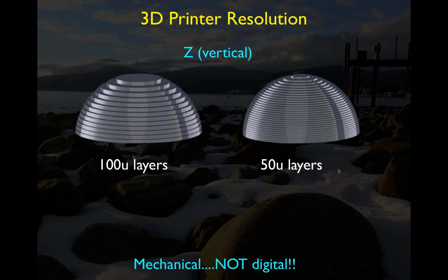And some of the printers, the transport for moving that build plate is not as accurate, and you don't get as consistent layers as sometimes you would hope for. That's a good question to ask about the accuracy or the dependability of the transport.